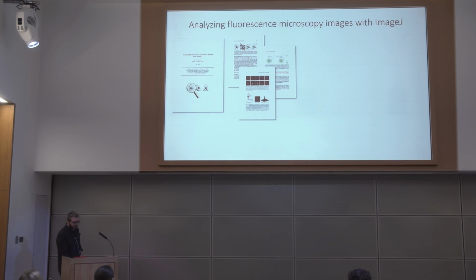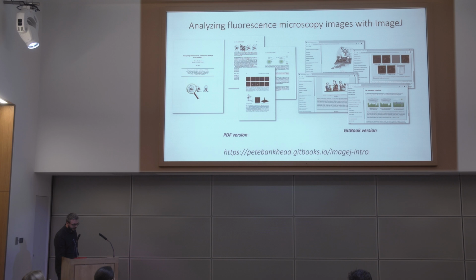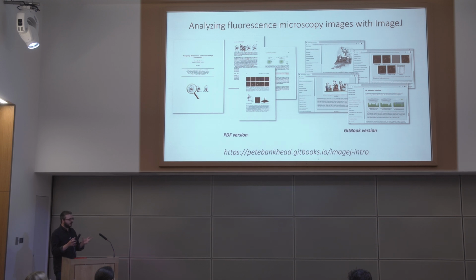So this is freely available online as well, both as a PDF and as a Git book. And so this is really my attempt to try and explain the concepts of bioimage analysis to people who might not have the time or the interest in delving into the really heavy textbooks in the field. And it tries to really focus on the practical skills and techniques that I used every day in the microscopy facility.